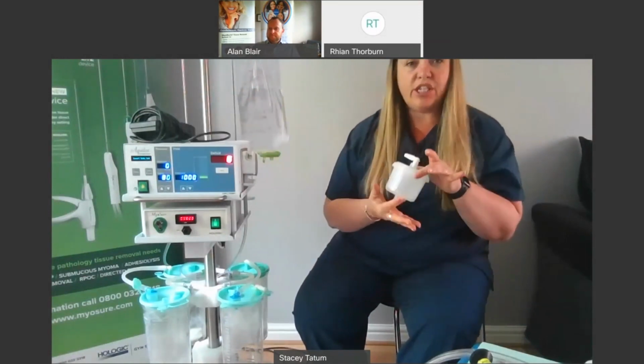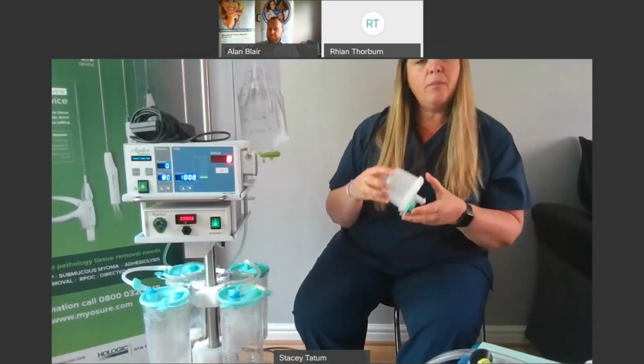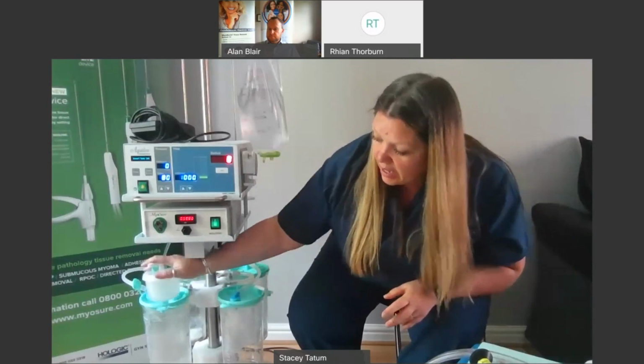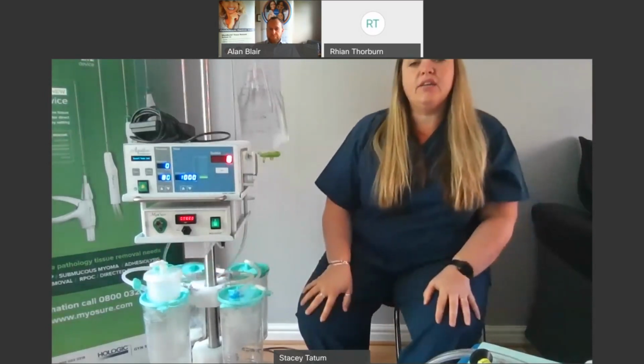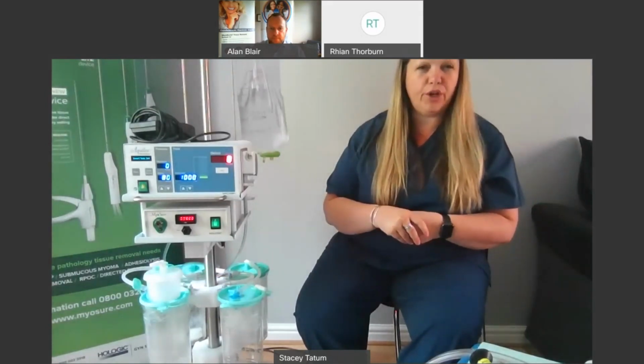You will also have a tissue trap on one of the canisters. They do come with their lids on, but they're not always sealed tight, so just give that a test. Put that on your canister, again, nice and tight. So Alan's going to show you a slide, bird's eye view of how it will really look.